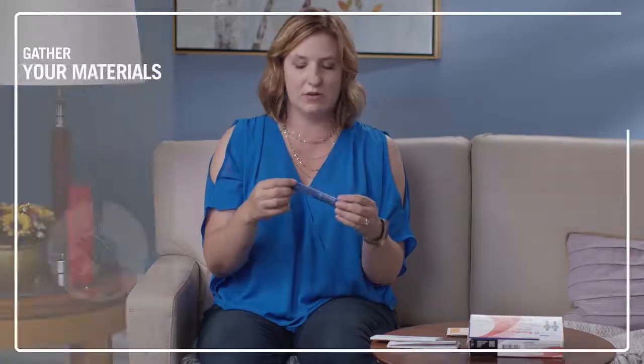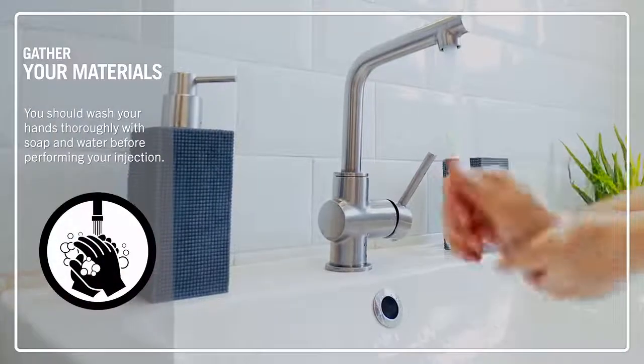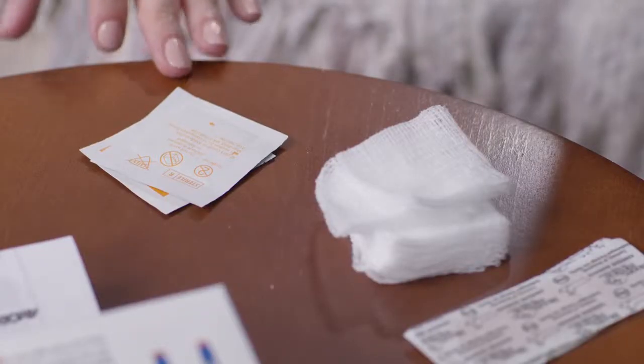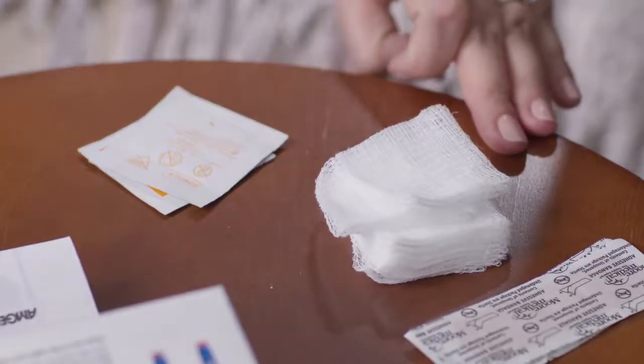When you're ready to begin your injection, wash your hands thoroughly with soap and water. You're going to need alcohol wipes, gauze pads or cotton balls, bandages, and a sharps container.